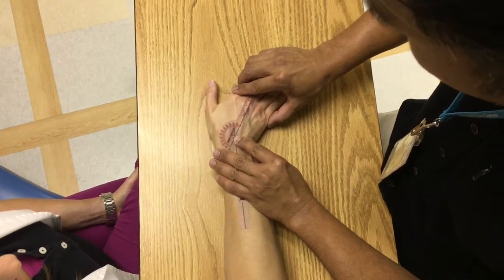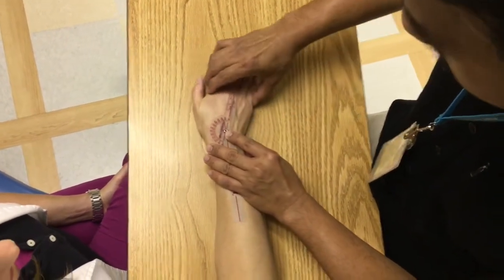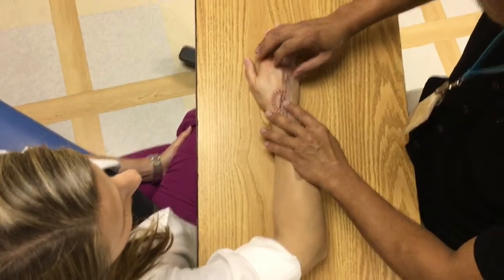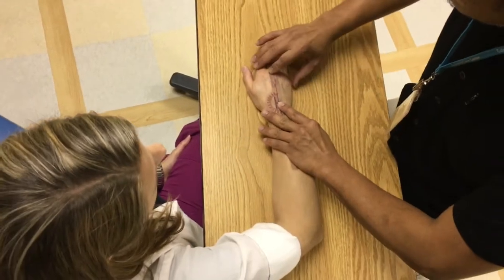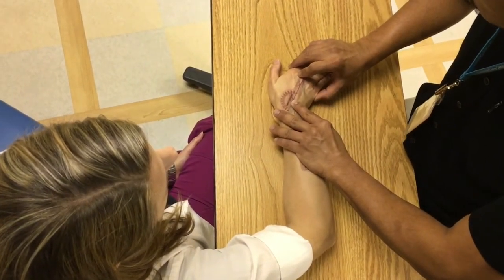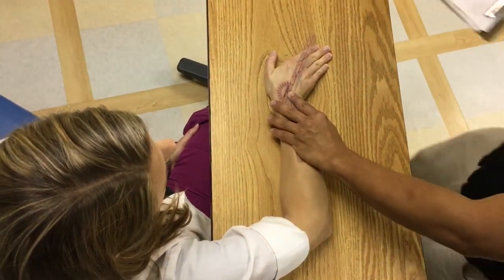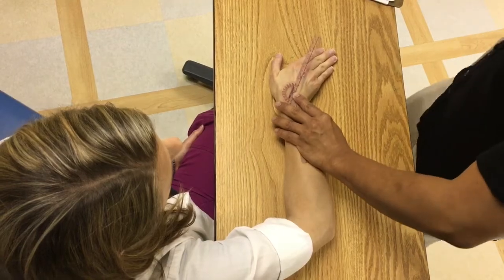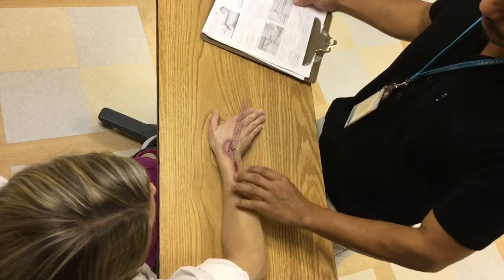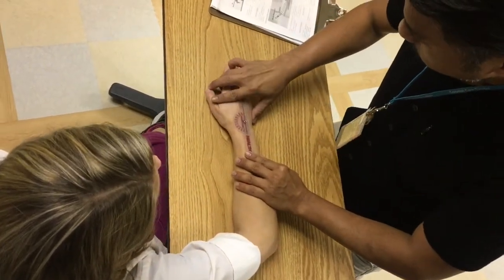Okay, let's do it again. Hold on, because it kind of moved. Okay, do it again. Perfect. So that's about 30, our ulnar deviation. 30. Let me list it down. Okay, relax. Go back to starting position.